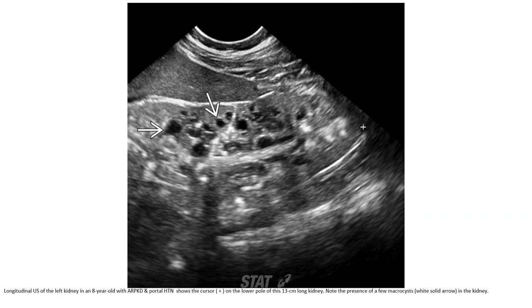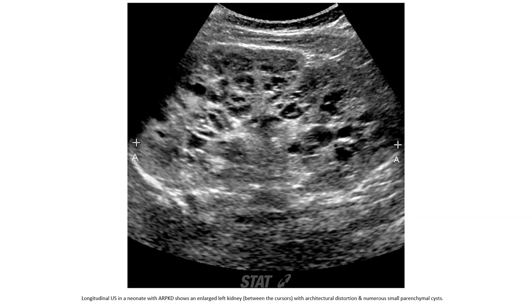Ultrasound of the left kidney in an 8-year-old with autosomal recessive polycystic kidney disease and portal hypertension shows a 13 cm long kidney. Note the presence of punctate calcifications in the kidney. Another case demonstrates a large left kidney with architectural distortion and numerous small parenchymal cysts.